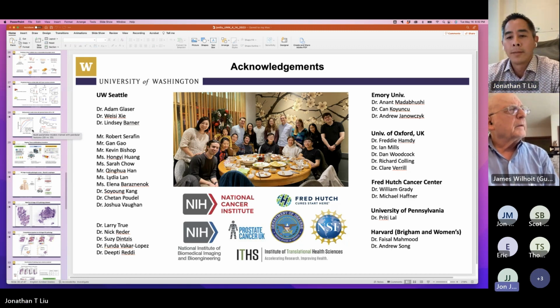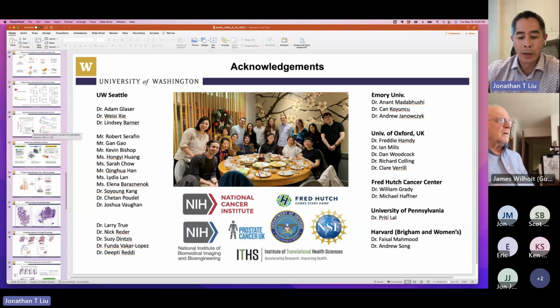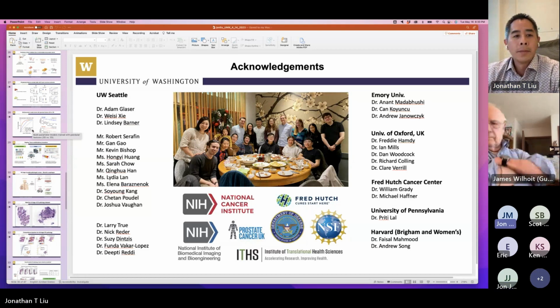So do you then have a sales and service organization that takes care of these, or are these one-off and people have to maintain the operation on their own? No, with these types of microscopes, there's almost always a service contract that's required, and actually most people who buy these want that because of the alignment and maintenance. You definitely need very skilled, trained technicians to be able to support that. So they put that into the purchase agreements, and that's an ongoing source of revenue for the company, of course, as well.